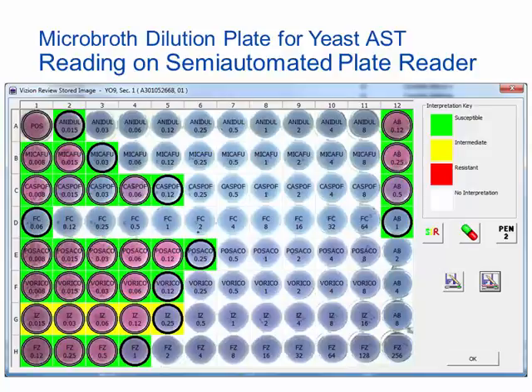For the echinocandins, there is currently a discussion occurring in the AST community suggesting that in vitro susceptibility testing of caspofungin may be technically challenging for reasons that are not completely understood yet, and which do not correlate with in vivo activity of the drug. Therefore, some experts are recommending using anidulafungin or micafungin AST results as the class agents for the echinocandins. This is still controversial and does not mean that caspofungin should not be used clinically if indicated. It simply means that in vitro laboratory testing of caspofungin may not be representative of its utility in vivo.